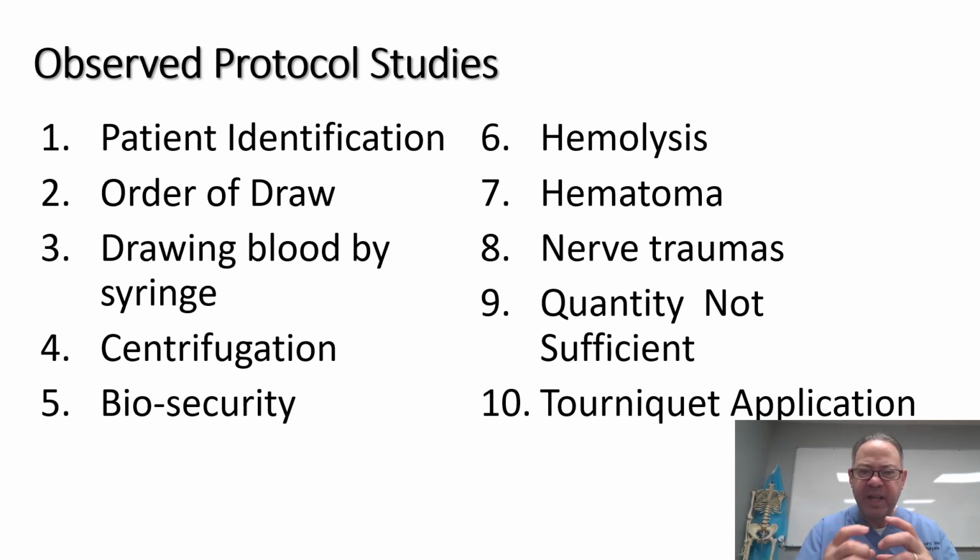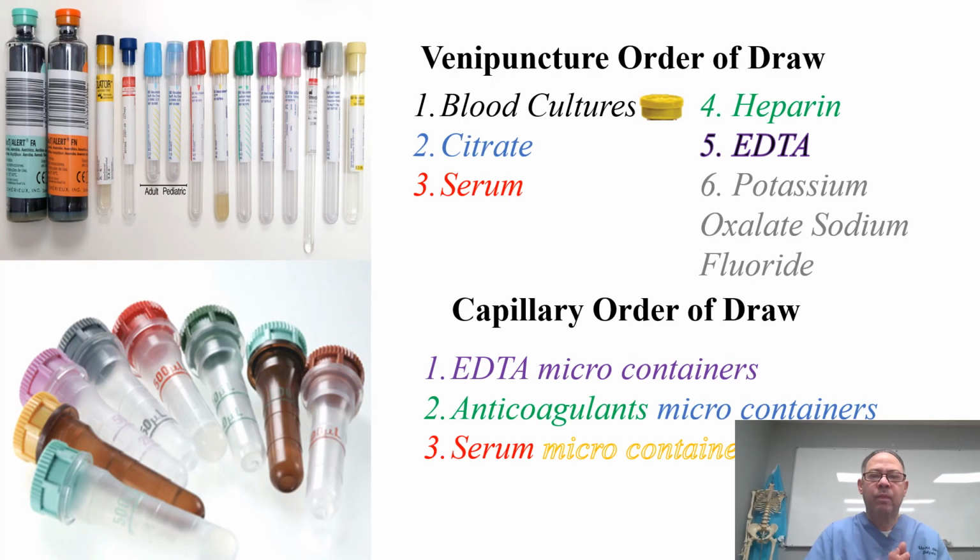Cantidades no suficientes en el tubo, es decir, que sacan un poquitito de sangre, okay? Hacen trauma a los nervios, crean estos hematomas, estos moretones en el brazo, cortan los glóbulos rojos, causan hemólisis, sin ellos darse cuenta, claro, okay? En la centrifugación, en sacar sangre con jeringuilla, en sacar el tubo antes del color que no está supuesto ahí, todo esto, all of that creates errors.